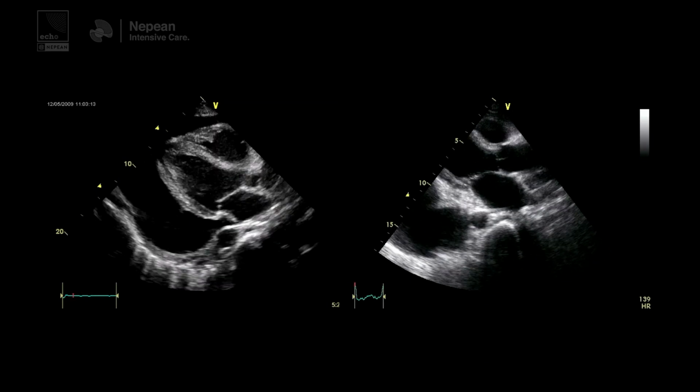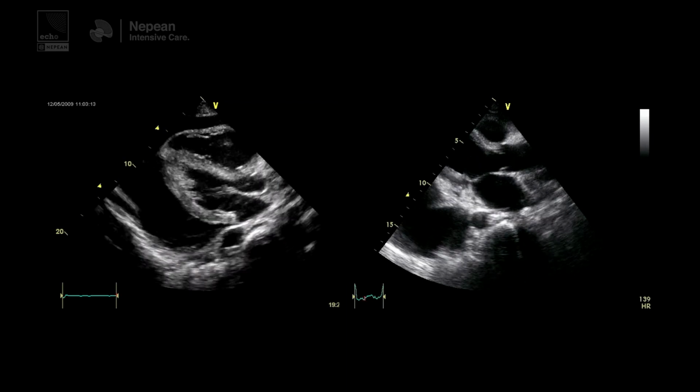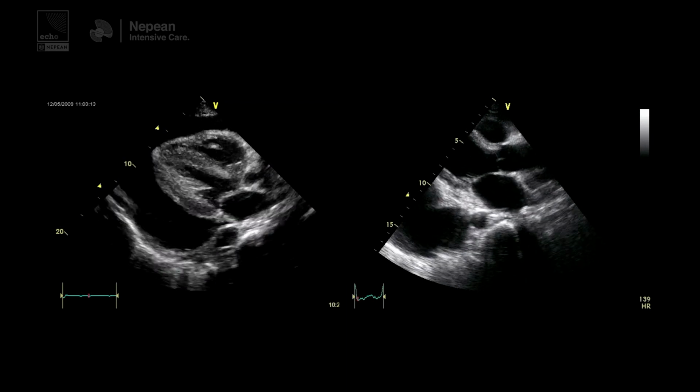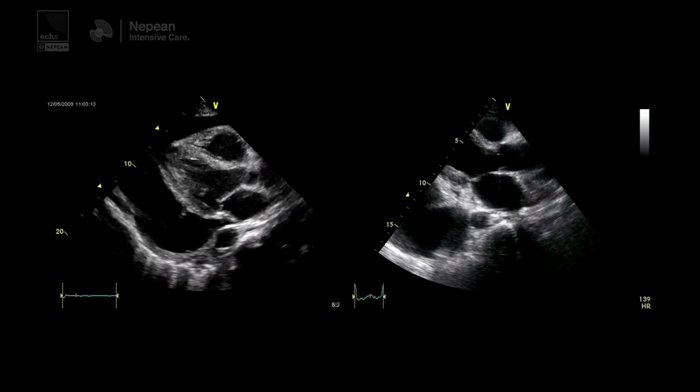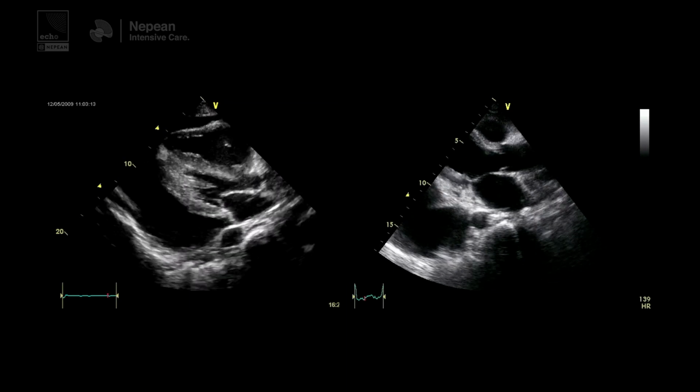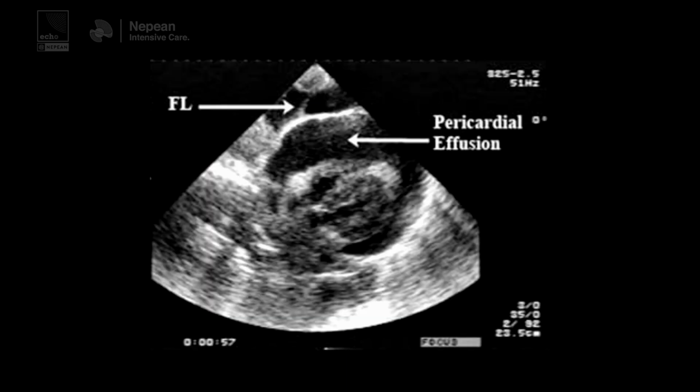I find that doing some lung bases as well can help too. Definitely. If you think this is pleural, they're definitely going to have a big pleural effusion at the base of the lungs as well. We'll definitely recommend doing heart and lung together, just using your same phased array probe and doing a quick lung ultrasound. And then the other one to differentiate is pericardial effusions from ascites.